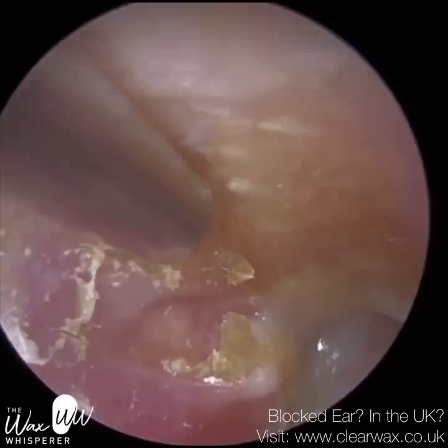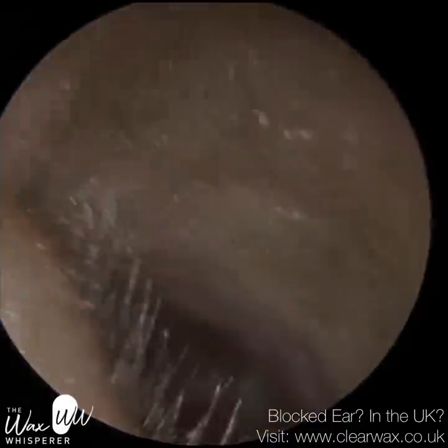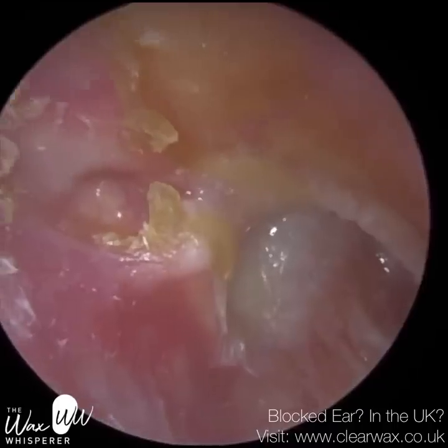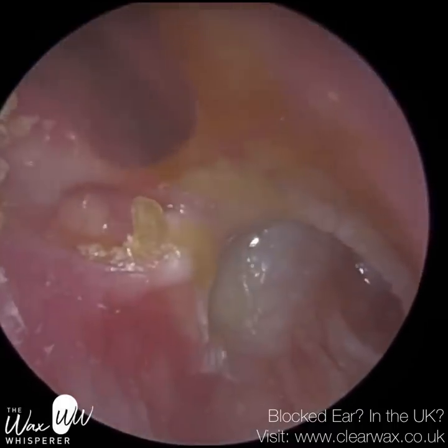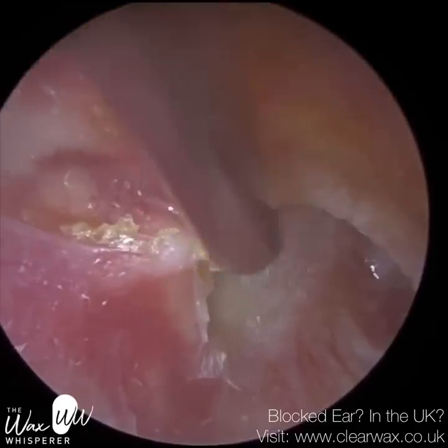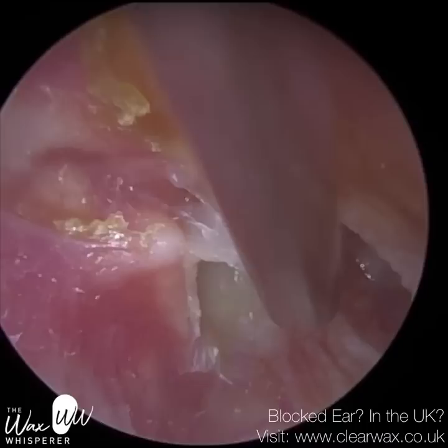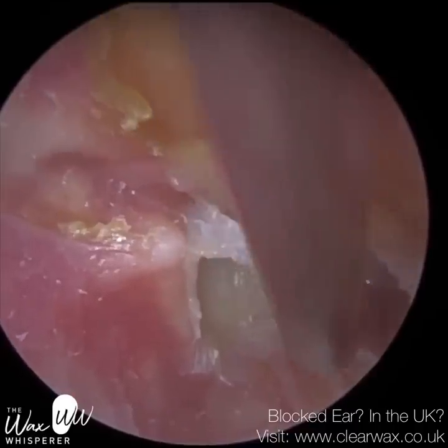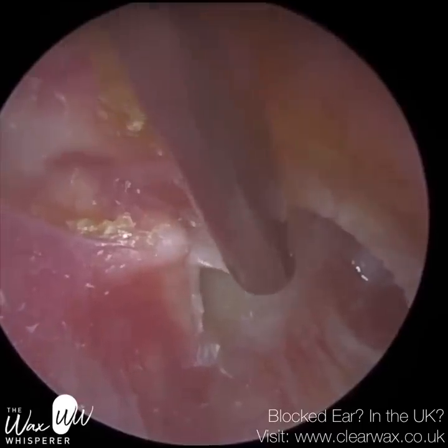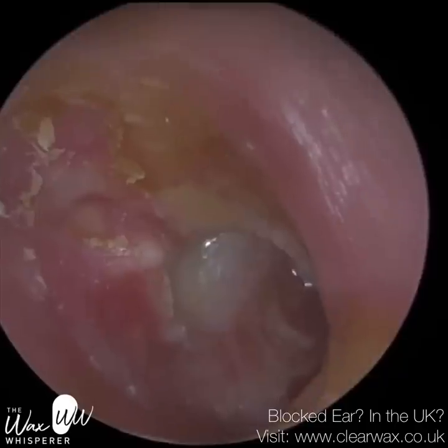It was a canal wall up, so they didn't have to drill into the mastoid region and the canal wall together, but it's possible they may need revision surgery. I'm trying to get some of this dead skin off. You can see where the sucker is underneath that white bulbous object — that's the short process of the malleus — which was protruding out of that layer of dead skin and did look like the dead skin. There's a little bit of skin left in there but I got the majority out. It was a bit uncomfortable in that region, but it's not ingressed — just on the surface. This patient is going to need antibiotic ear spray, and I've arranged for them to see their ENT specialist.